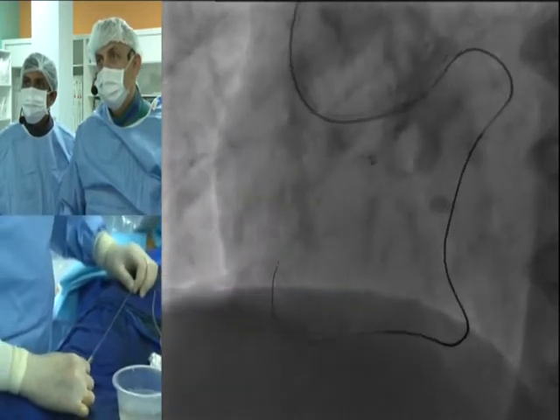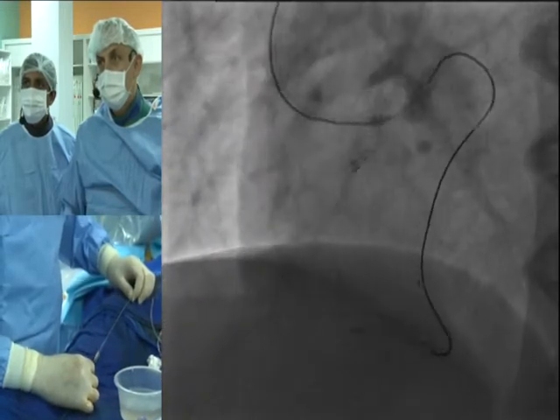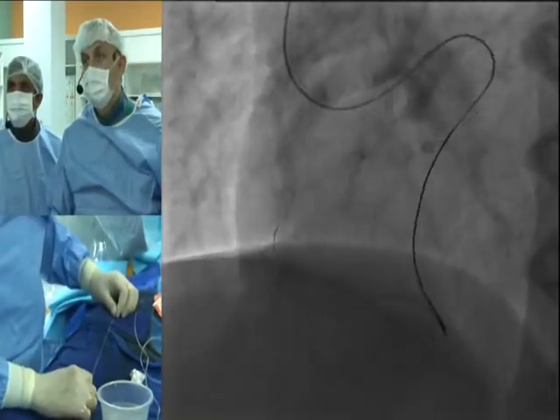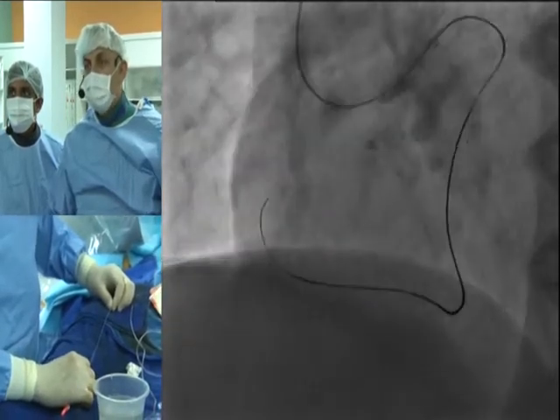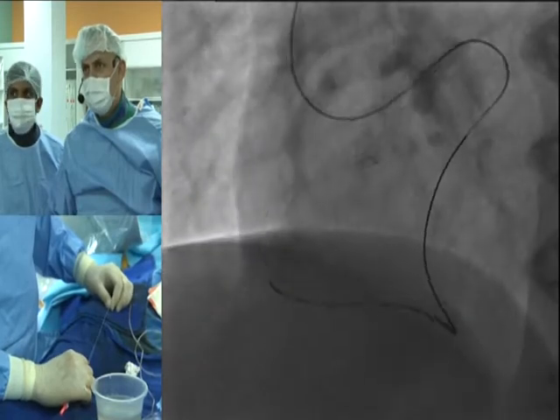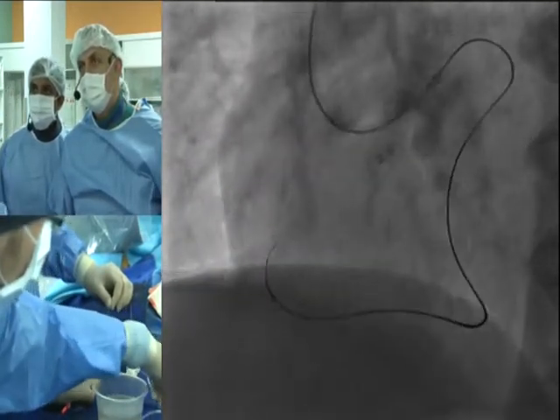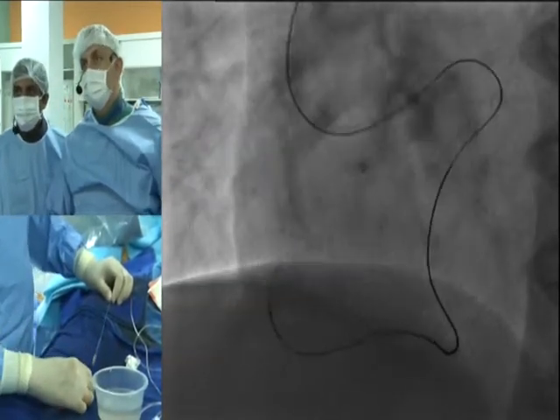I need some more Corsair support. I'm pushing my Corsair slowly. I have to push my Corsair slowly because I'm using septals, so each systole keeps the Corsair fixed. So I have to respect that. That's why I cannot push. It's better to do it with each respiration and heartbeat.